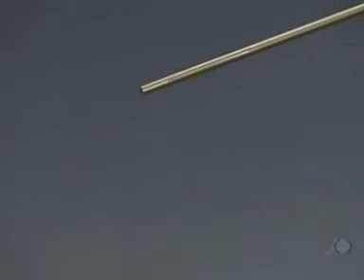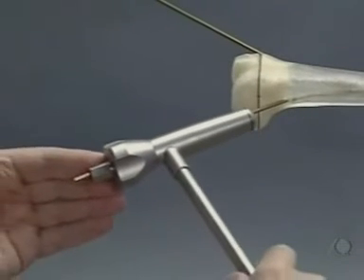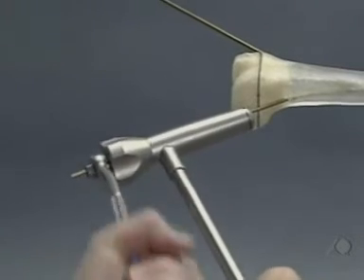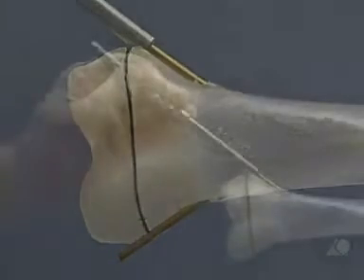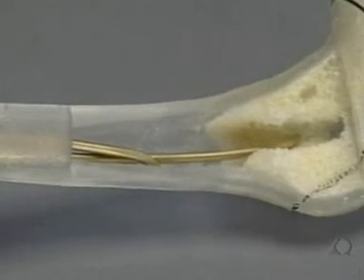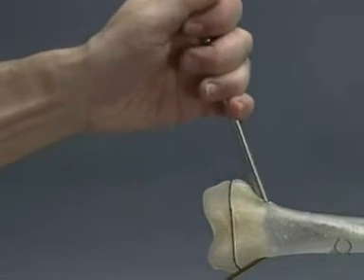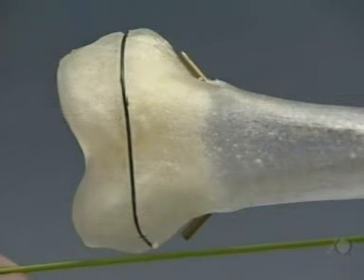With the nails in this position, it is recommended to shorten them to the required length using the cutting instrument; the end to cut is inserted through the appropriate marked opening in the cutter sleeve. Care must be taken to ensure that after final positioning, the ends of the nails do not protrude too far. Using the beveled impactor, the nails are brought into the planned anchorage position in the proximal metaphysis with gentle hammer blows; the beveled part of the impactor must reach the cortical bone. This guarantees a projection of about one centimeter, and the ends are bent slightly upwards to make later nail removal easier. Positioned this way, the ends of the nails lie securely under the iliotibial tract and allow free movement of the knee.